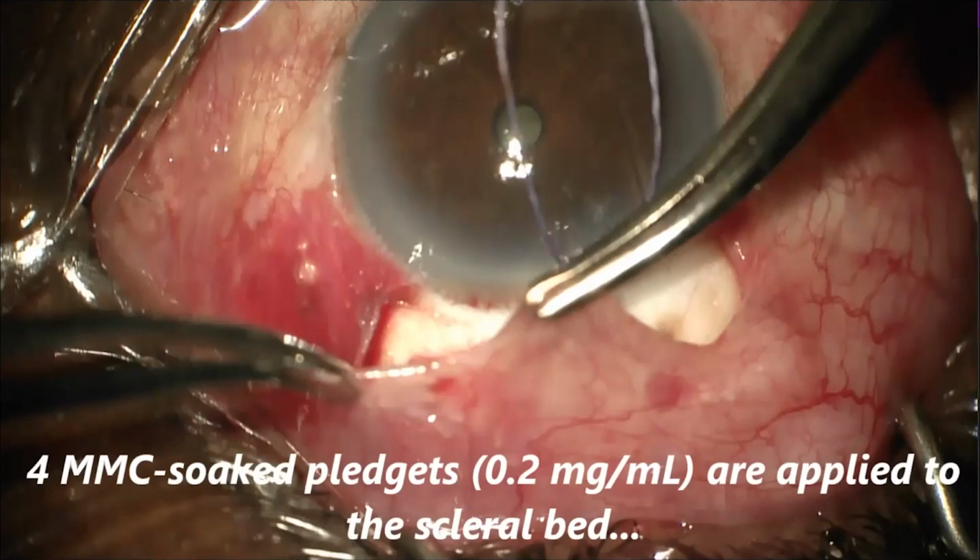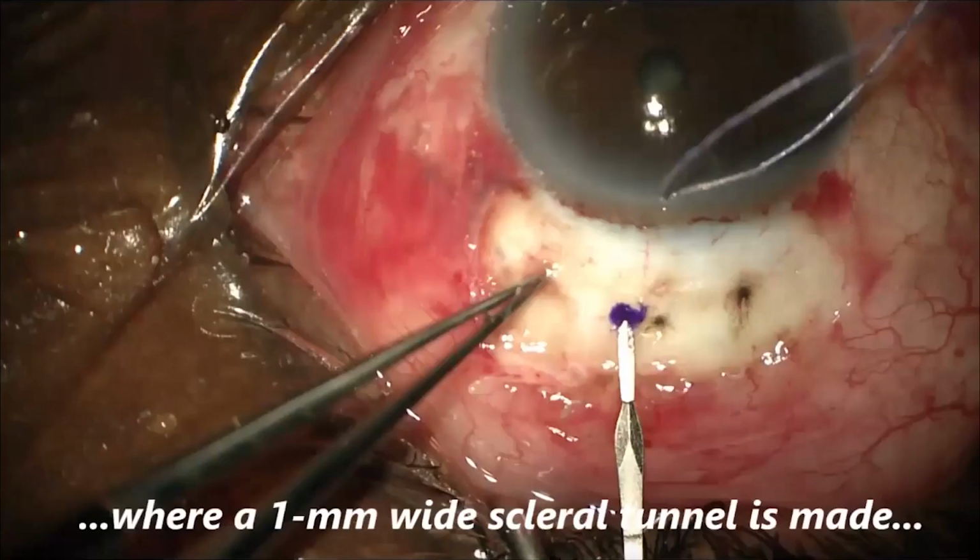This is an area that needs to be watertight. This is the key step. So you've removed your mitomycin C soaked pledgets. You've rinsed the area. Now you're going to make a mark 3 millimeters posterior to the limbus.